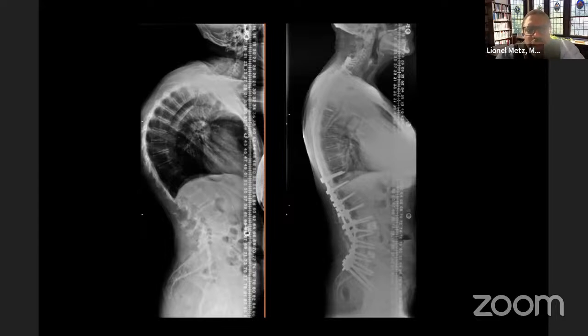These severe Scheuermann's cases are challenging, particularly in adult patients. I think looking at her preoperative X-ray, if I met her today, having gone through what I went through with her, I probably would have erred on extending her into the cervical spine up front. I think one of the things that we don't appreciate with these patients, particularly with these severe Scheuermann's, where we stop at T2, is the entire rib cage, the thorax, is pulling on T1 through the manubrium and the rigid attachment to the T1 ribs.